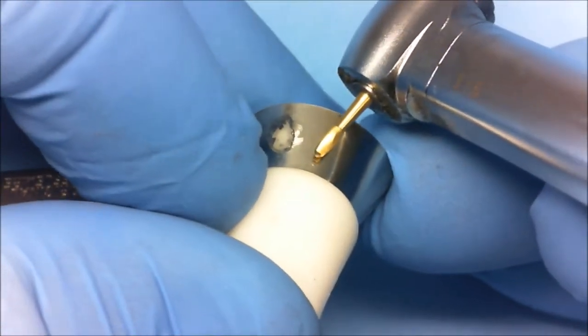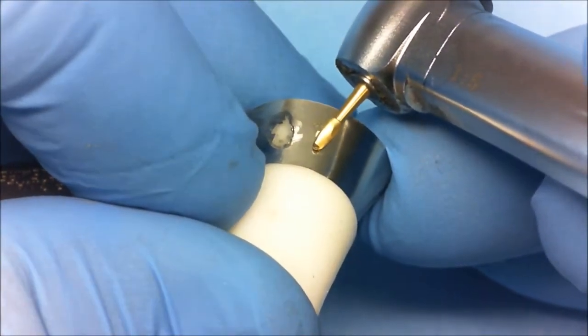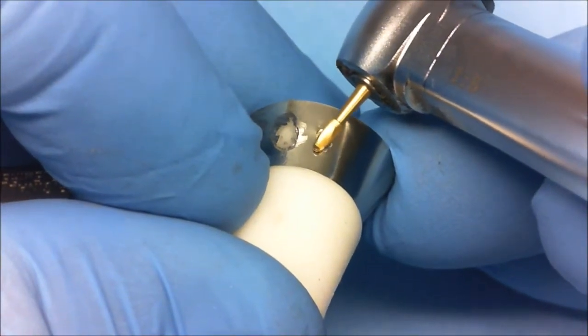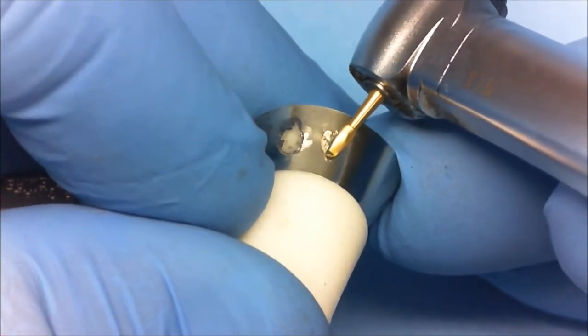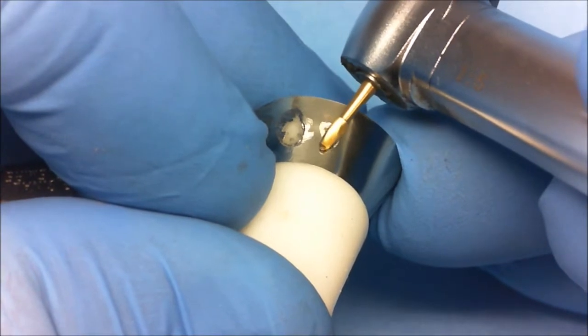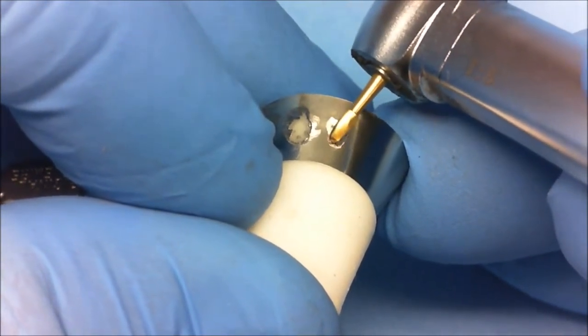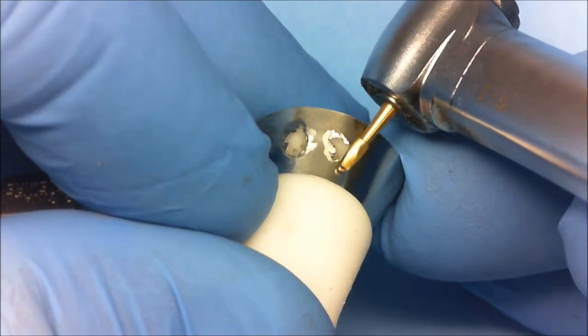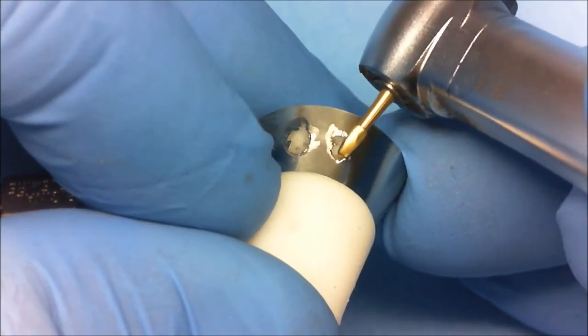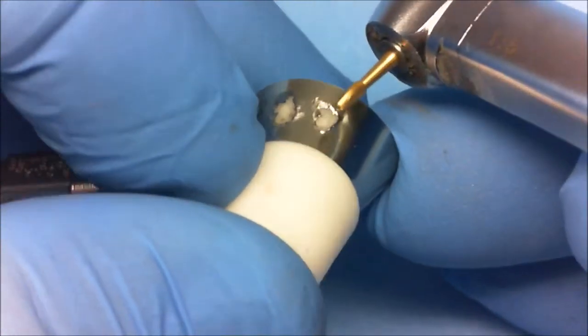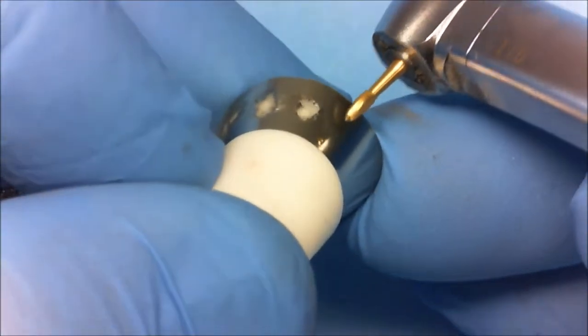The carbide does not work as well. You will notice that the flutes tend to catch the matrix edges, which causes sudden flaking. As a result, you do not have the same control as when you use the diamond. You can see this as I make the next two openings using a small, egg-shaped carbide.